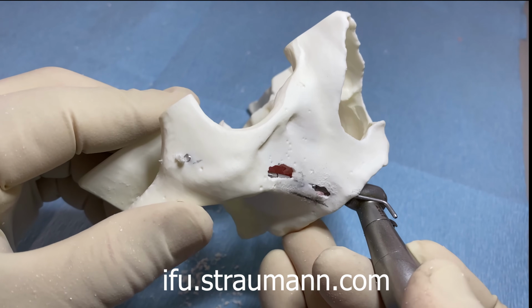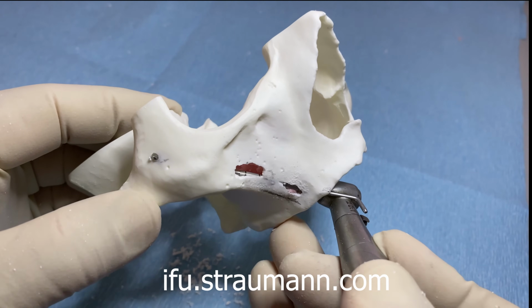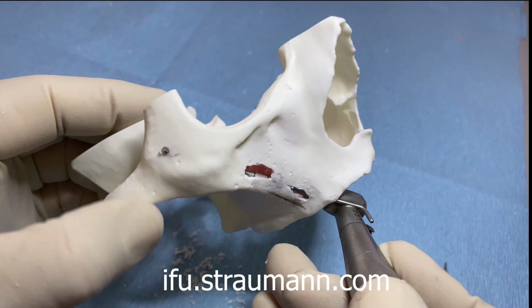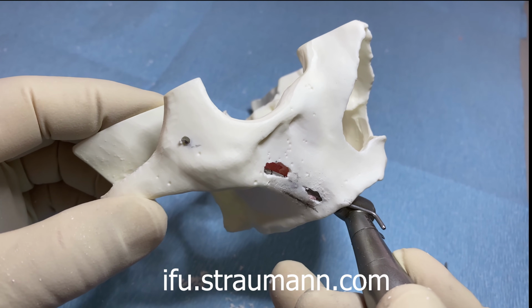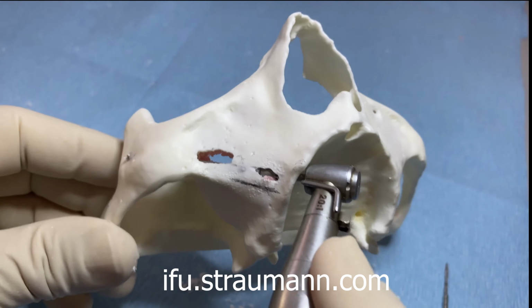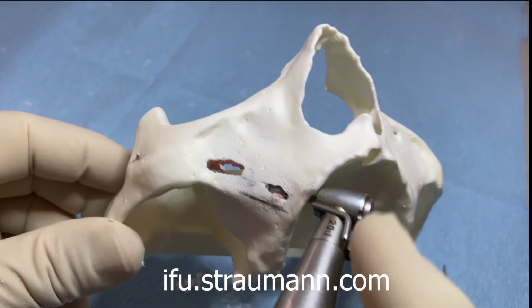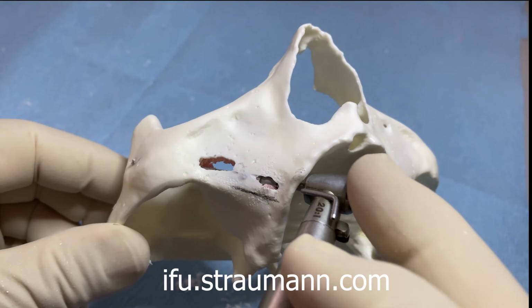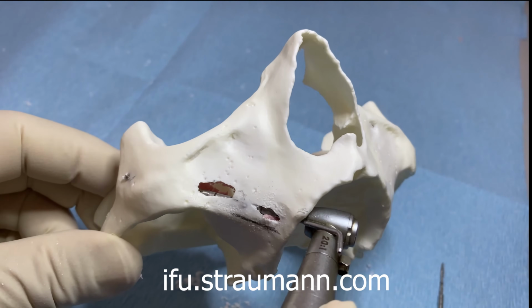It is very important to see this opening, because if we cannot see this opening, we will not be able to measure the depth of the implant to integrate. One thing that's very neat to see in this particular presentation is, if you can see, the head of the handpiece now is hitting the bone, and I cannot go any further.